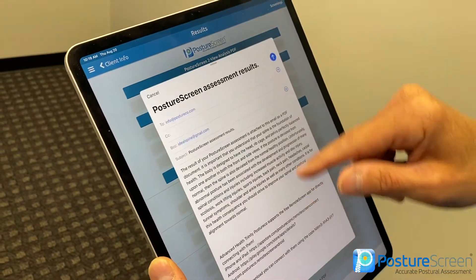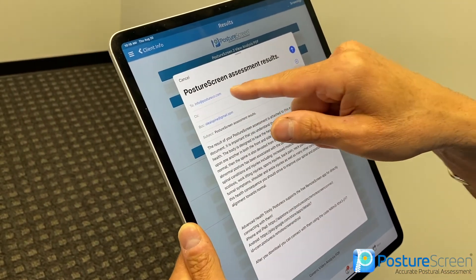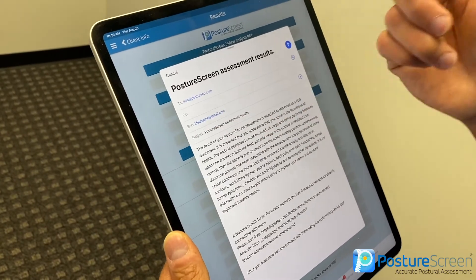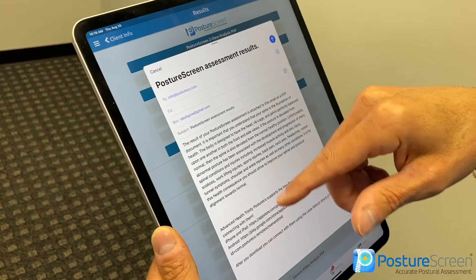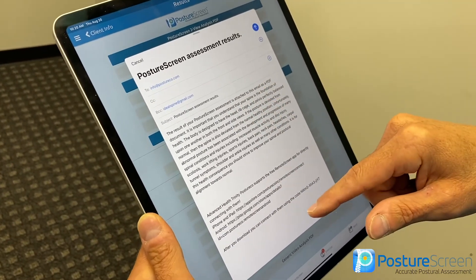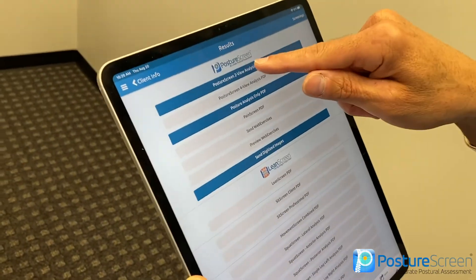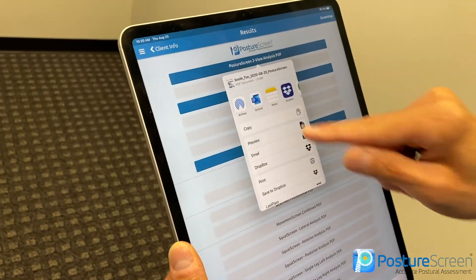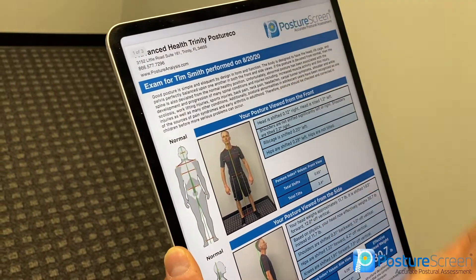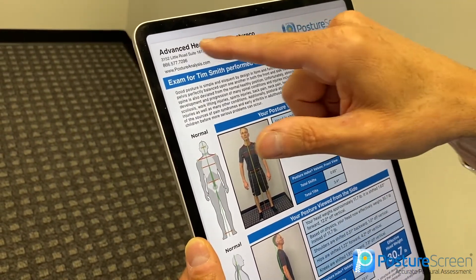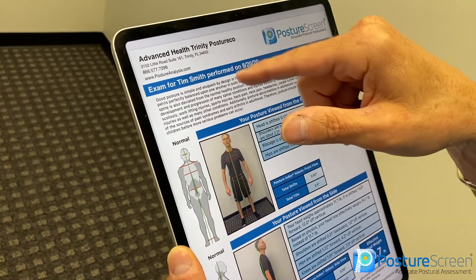Hit email, and it will send from whatever address is your default address on your iPad or iPhone. You can blind carbon copy it to your staff — all of that is in settings. You can totally customize all the verbiage if you're on an unlimited assessment subscription. If you want to preview the PDF, hit Preview — you can change the colors, change the text, remove the PostureScreen logo, and put your own logo. You can totally customize PostureScreen to suit your needs. That concludes our two-view analysis with PostureScreen Mobile. For more information, reach out to us at support@posturescreen.com. Thanks everyone.